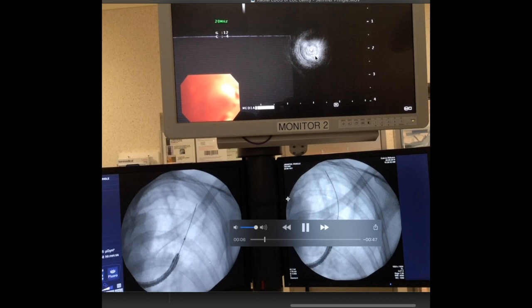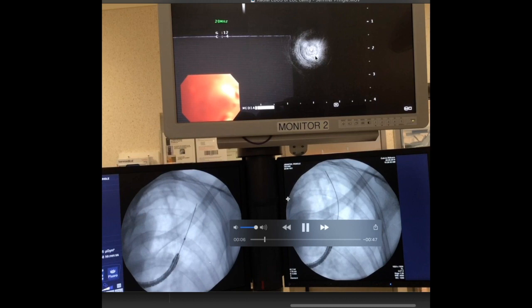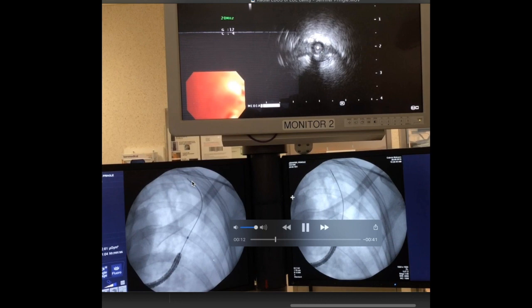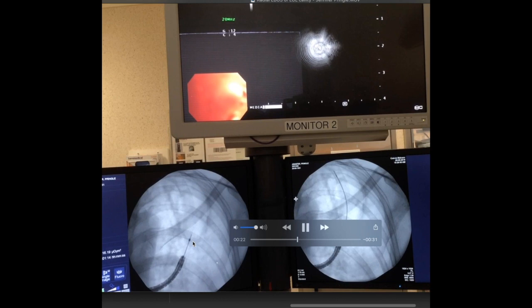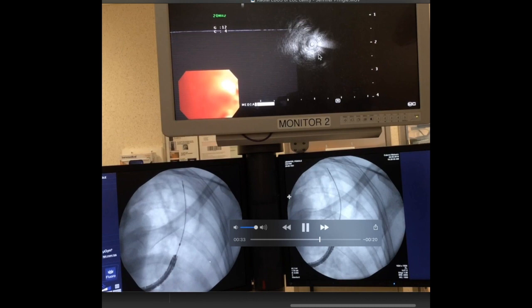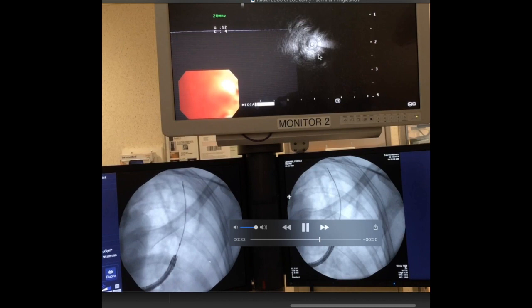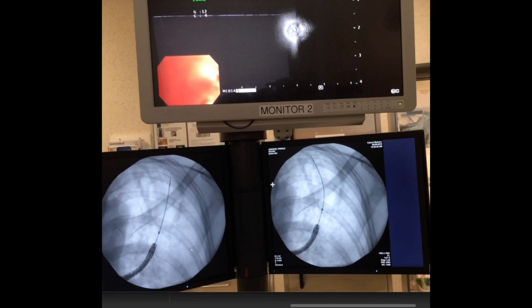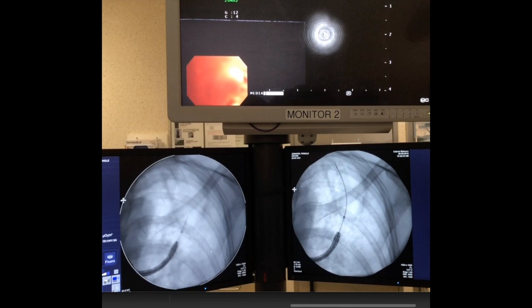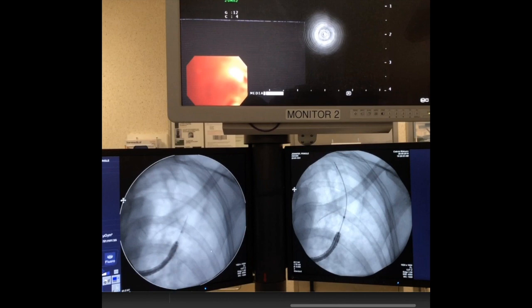Here's the ultrasound image being pushed out — this is just the artifact from air. As it gets to the other side of the cavity you can see it's bending around within the cavity, and this is starting to see some solid area which is the other side of the cavity wall. Coming back through the cavity and down, we become solid again — that's the solid area of the wall. Back out to the other side of the cavity, bending right around, and this solid area is confirmed from the ultrasound. That allows us to guide biopsies from the wall of the cavity.